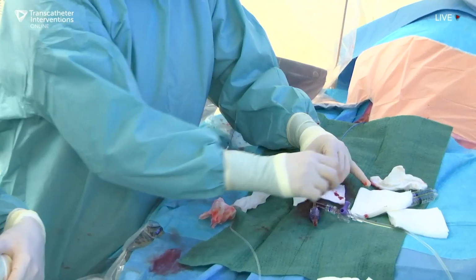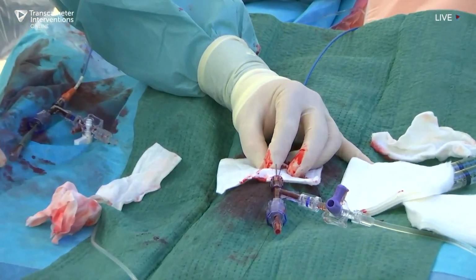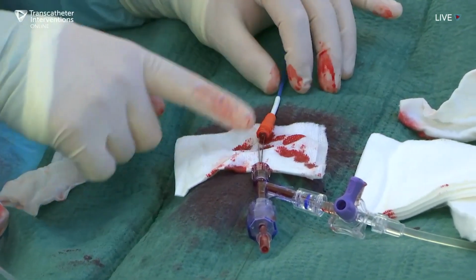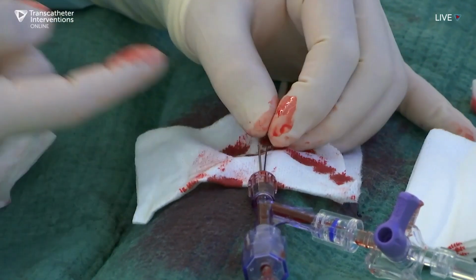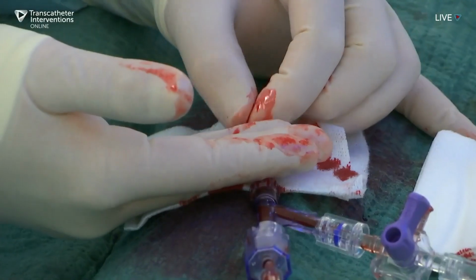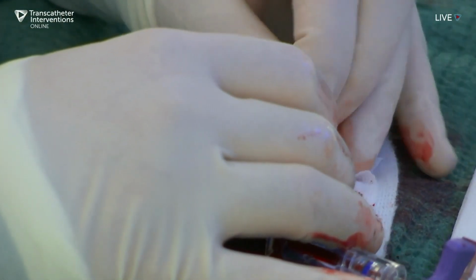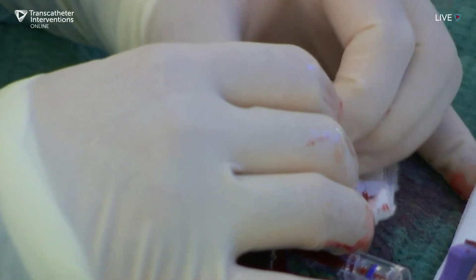So you can see here the externalization of the wire. It's coming from the left system up to the epicardial in the right system, and now we have here the externalization of the wire. You see them? And then he'll load that on the wire introducer, which allows it to then come out through the Y adapter.